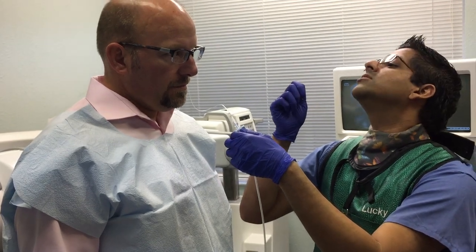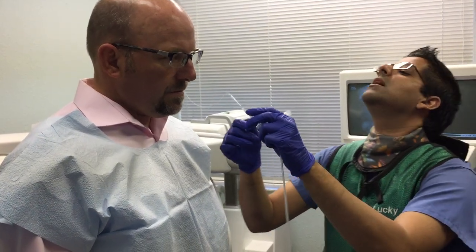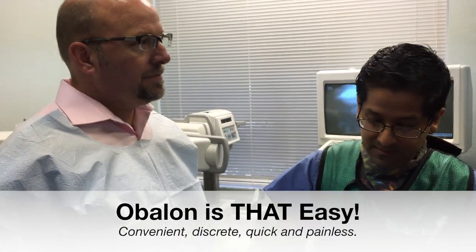Okay, when I try to remove it, you're going to look up, open your mouth, get ready. This is going to release the catheter. So here we go, ready? Okay, head up — you're going to feel a pull. It's coming out gently. A little more head up, there you go. Done. And there's the needle. Excellent.